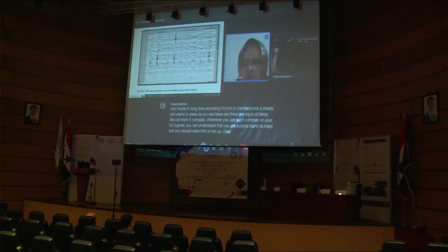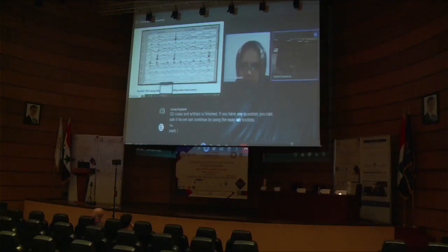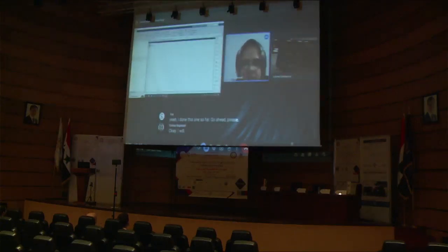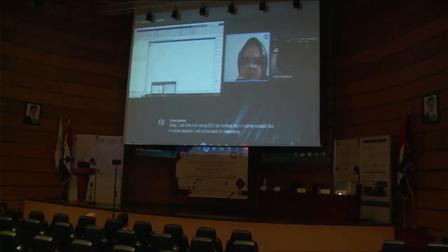Okay, at this stage, the introduction of EEG noise and artifacts is finished. If you have any questions, you can ask. If not, we can continue by using the Eeglab Toolbox. Go ahead, please. Okay. I will dive into using the Eeglab Toolbox, but in some sessions I will come back to describing some other theories.